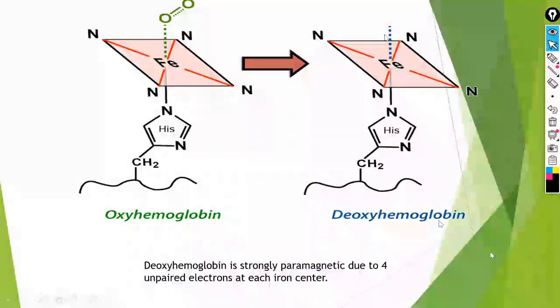So, going back, Dr. Islam said that since there are free electrons, there will be a magnetic field. Since there is a magnetic field, it will affect the hydrogen present around it, causing inhomogeneity in the magnetic field. Why? Because it will itself generate a magnetic field, thus causing a change in the main magnetic field, which may help in dephasing or not.